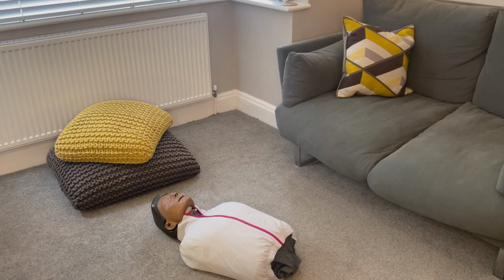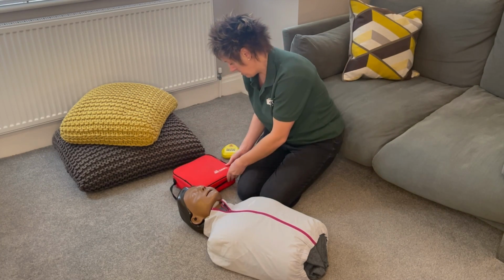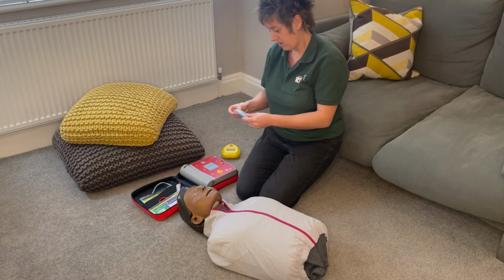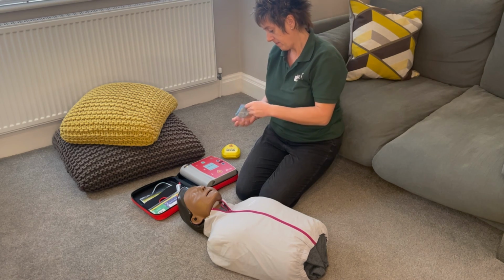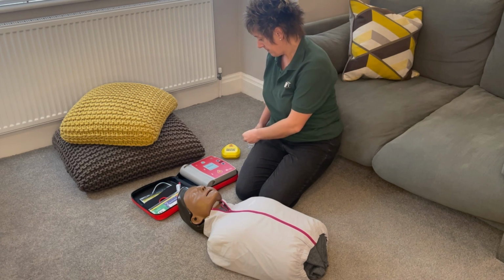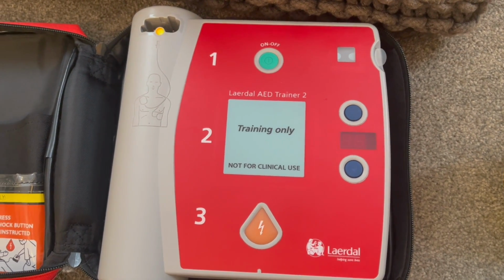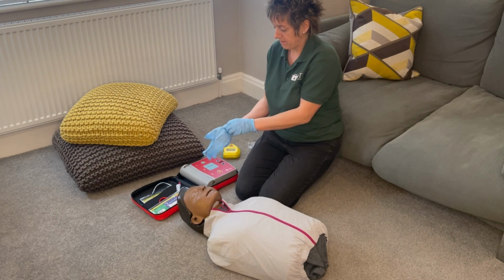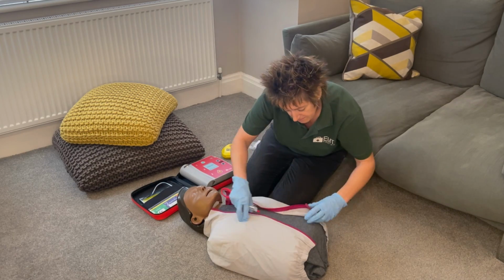I return with the AED. The first thing I do is open it up and turn it on because it's going to talk to me. It's going to tell me exactly what to do. I'm then going to make sure I'm wearing the correct PPE, so I'm going to get my gloves on in this case. I'm then going to follow the instructions. Apply pads to patient's bare chest. The first thing I need to do is have a naked chest. So I need to remove the clothing off this casualty.